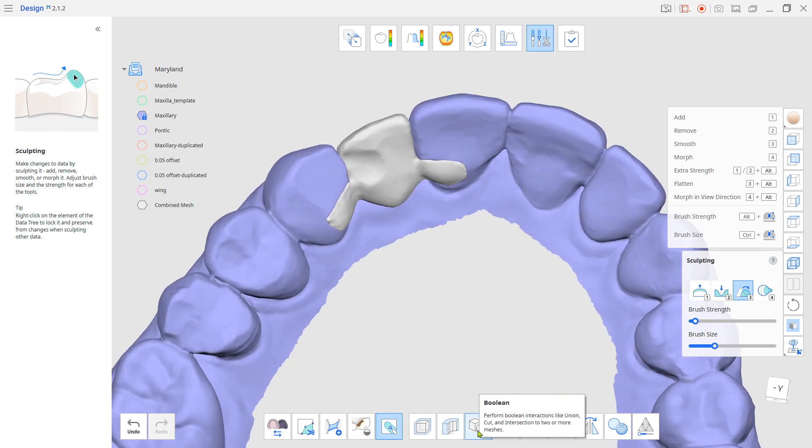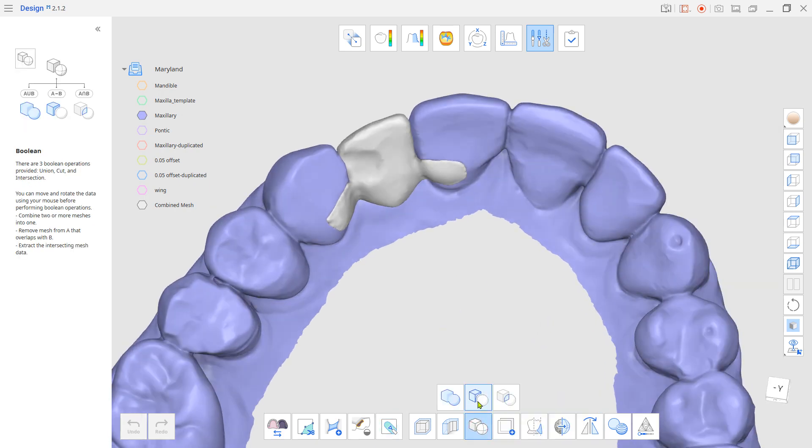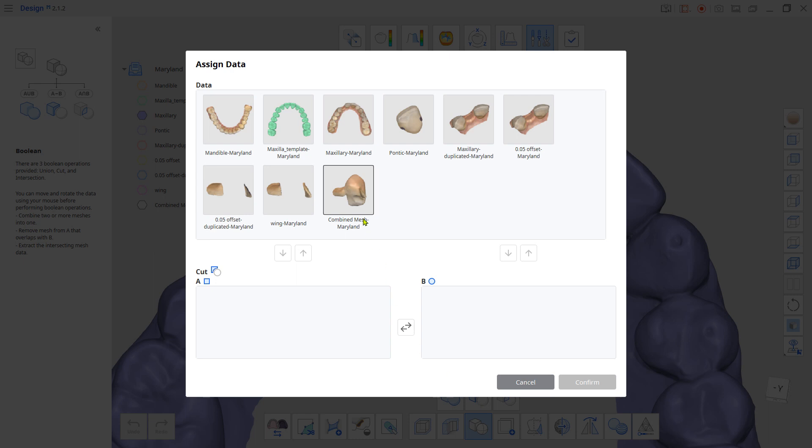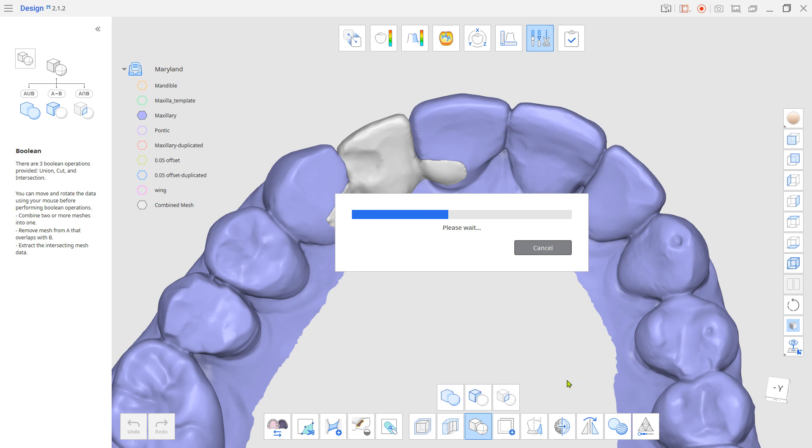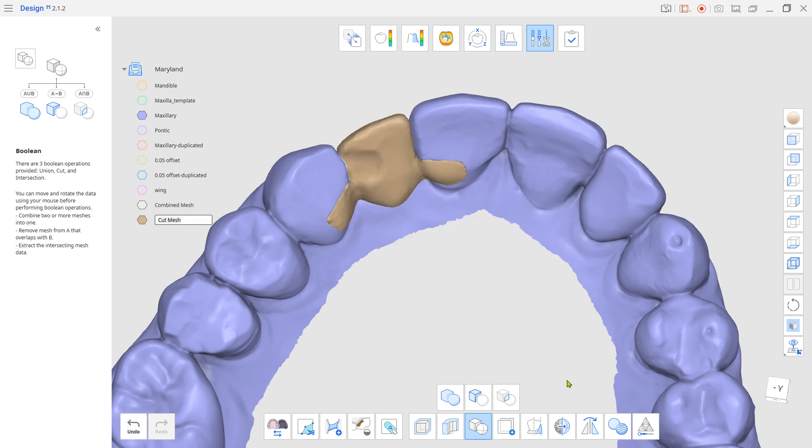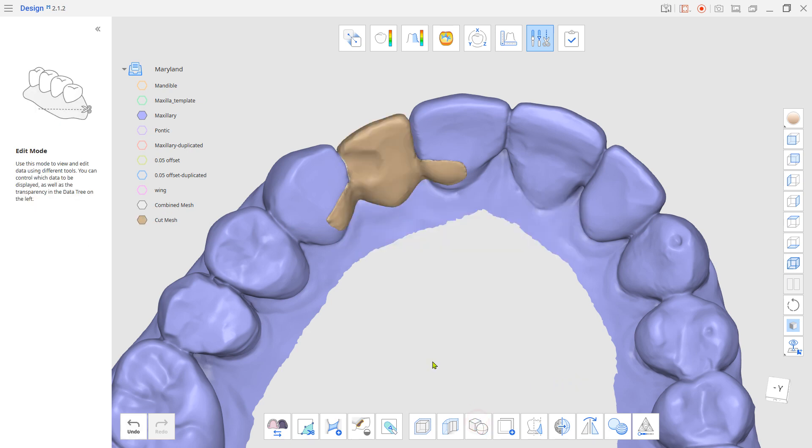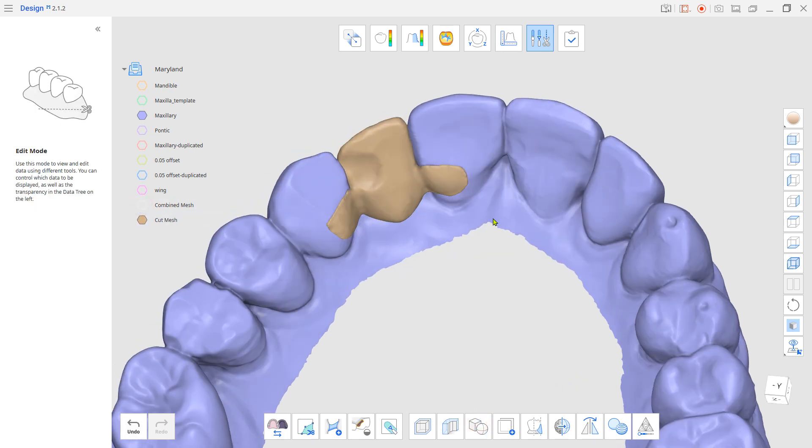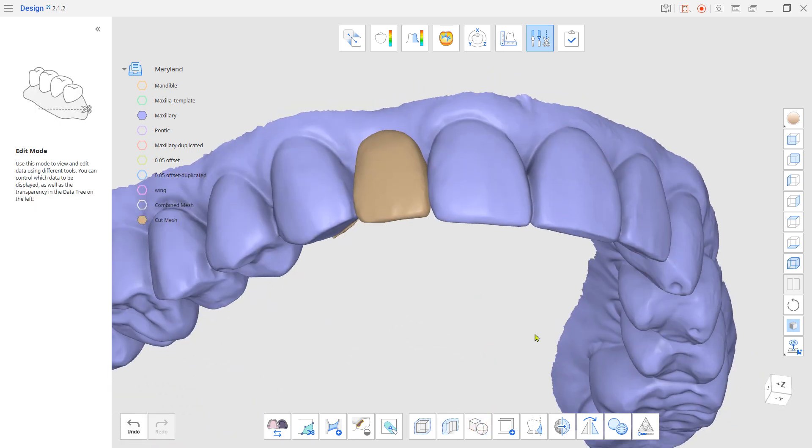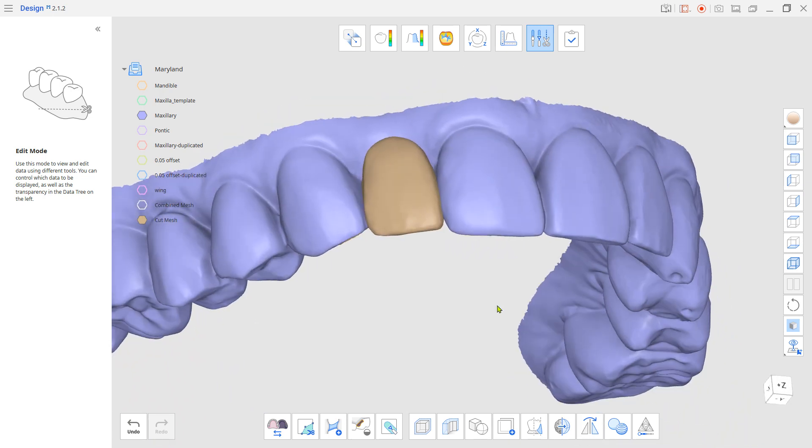Use Boolean to cut the offset given the adjacent data from the Maryland Bridge. Now you have a full-contour Maryland Bridge.